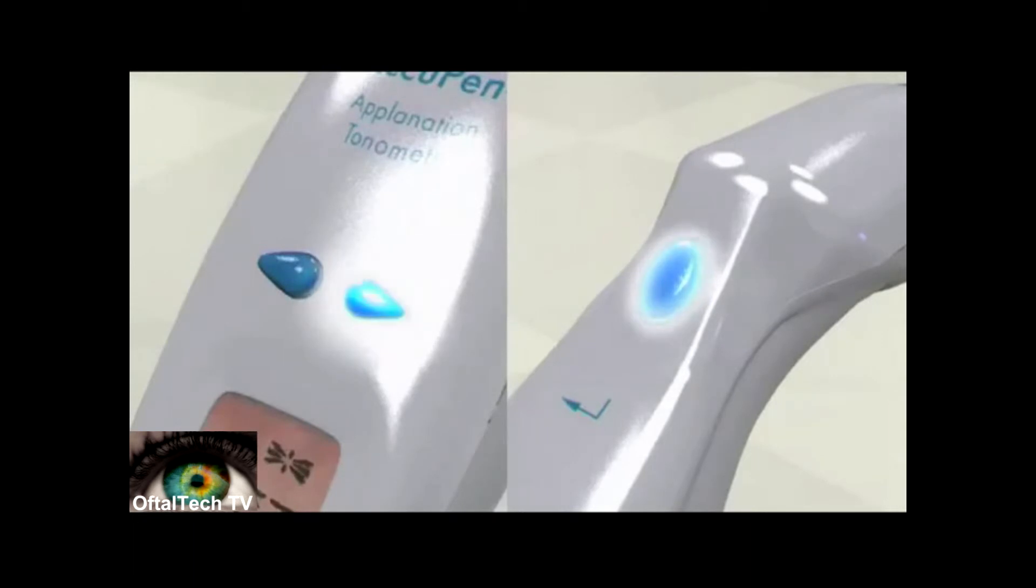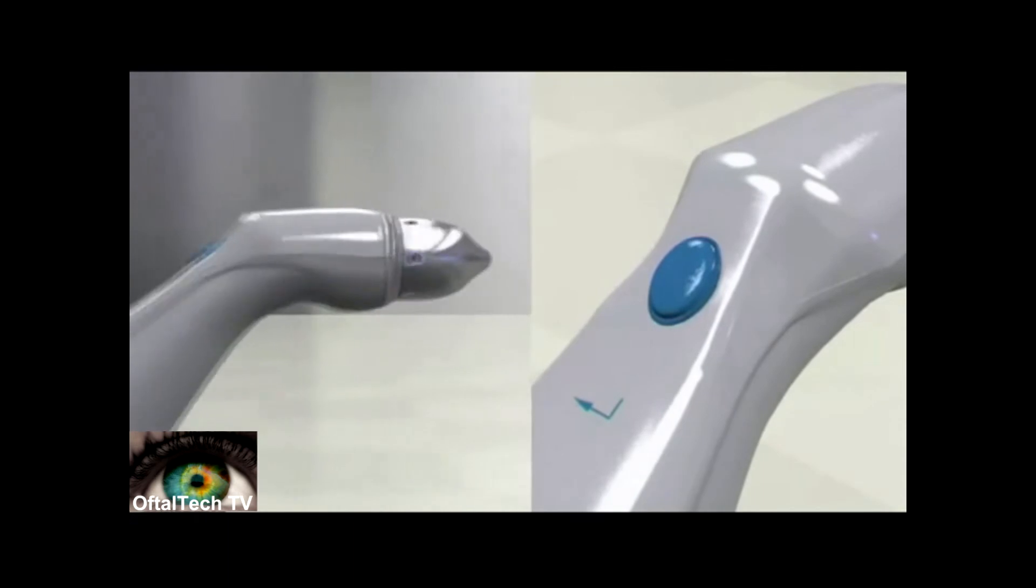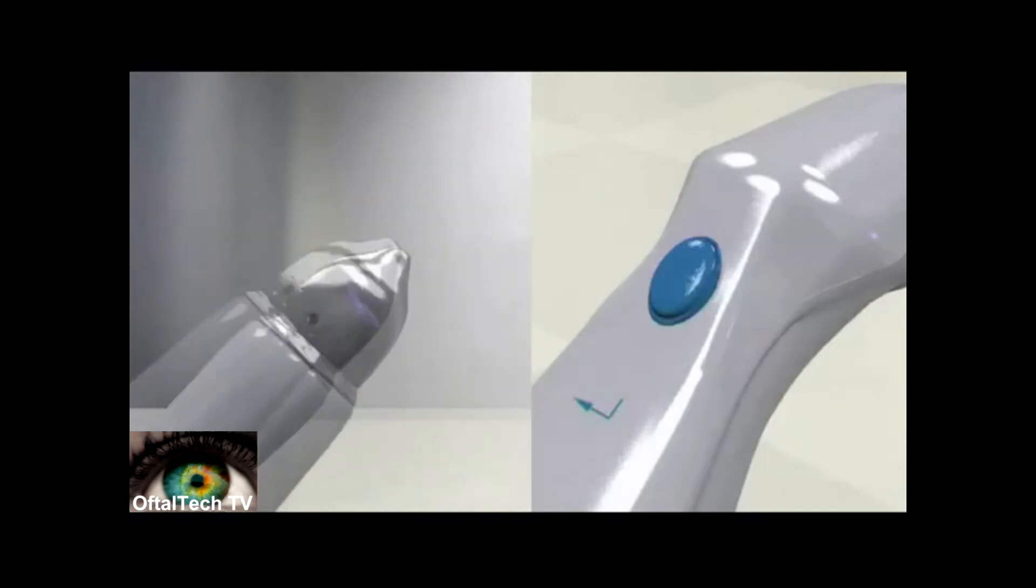Hold the transducer horizontal to the floor and press the action button. The unit will chirp and display probe up. Hold the unit so that the transducer tip is pointed directly in the air and press the action button.